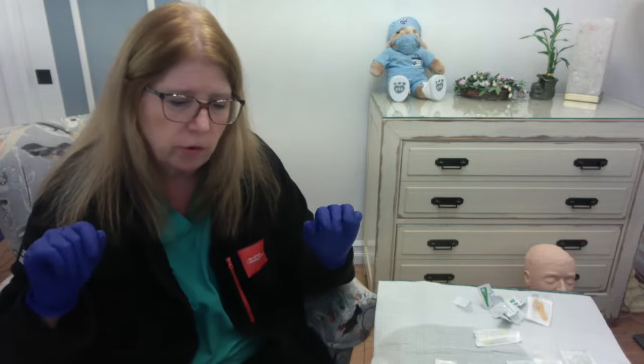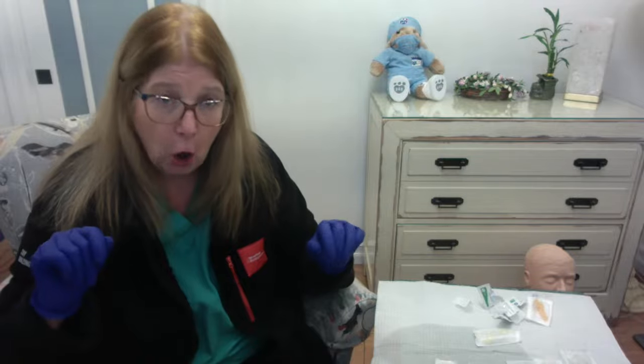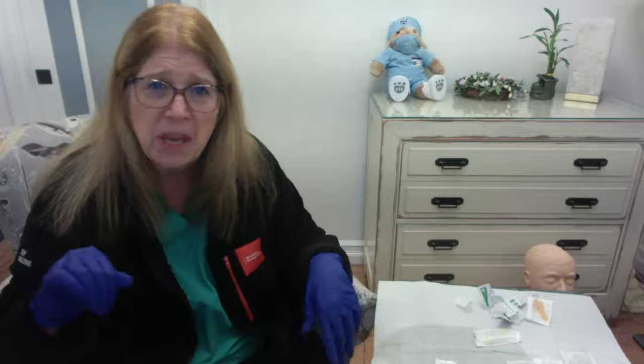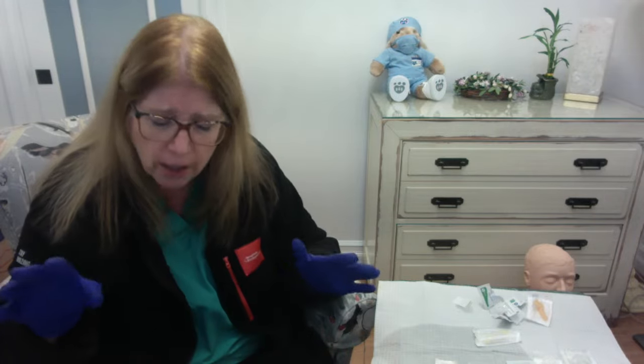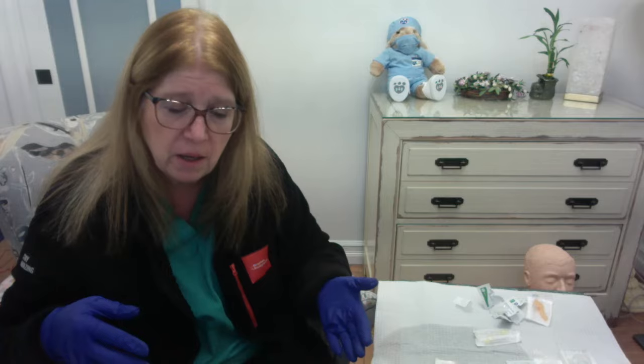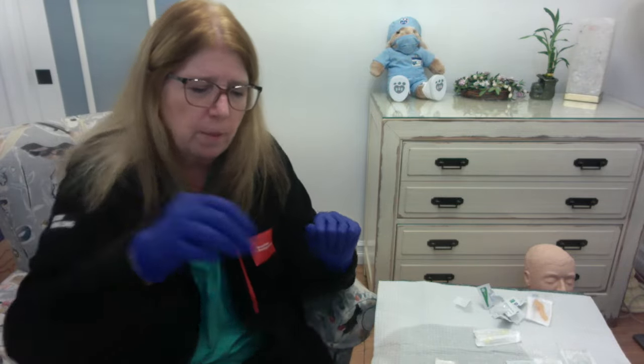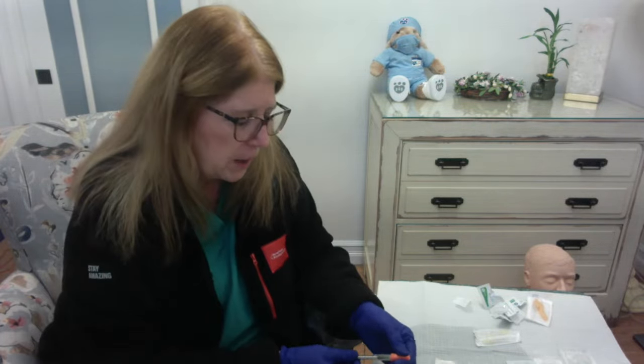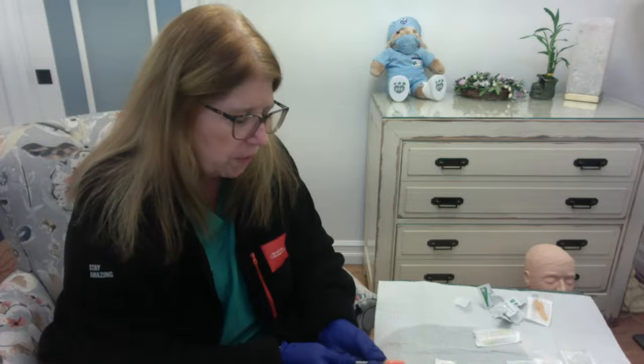Now comes the subcutaneous injection. So subcutaneous injections are also given with small, short needles, so 26 to 32 gauge, maybe 5/8 or 3/8 of an inch to a half an inch. On occasion, we use a full inch needle, but that would be for a patient who has a large amount of subcutaneous tissue. Okay, so we're going to practice with that insulin that we drew up before.